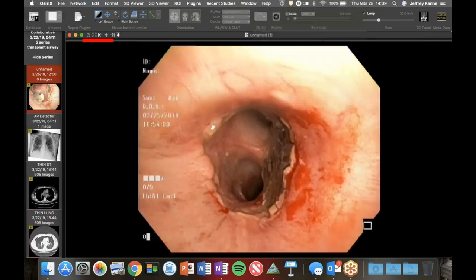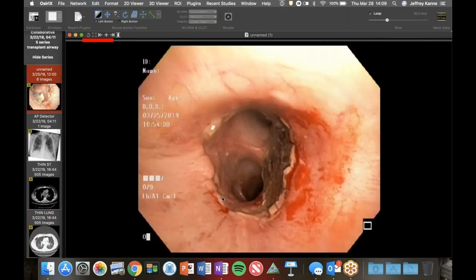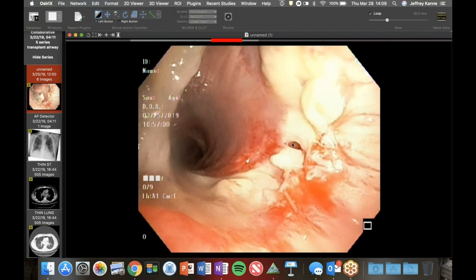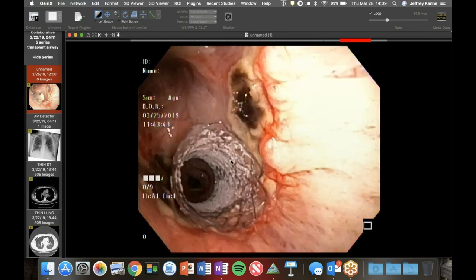They did a bronchoscopy. You can see the suture line with some blood in there. Going further down, right here you can see a little hole - that's what we were seeing on the CT scan. So that's the little anastomosis defect. It's granulation tissue that formed there - not an infection, just a little breakdown. They put a little stent across it and he's doing much better.